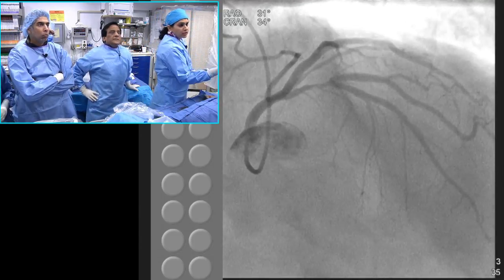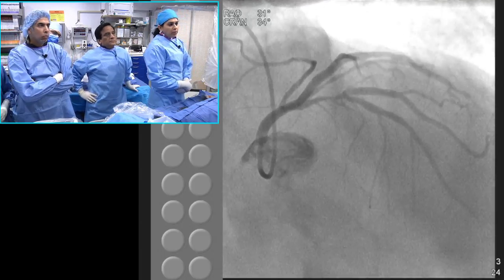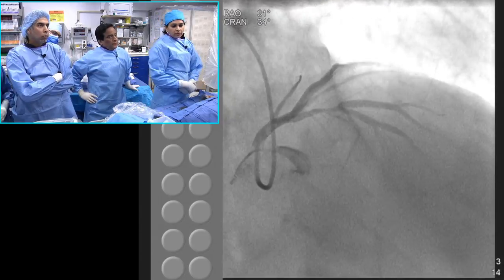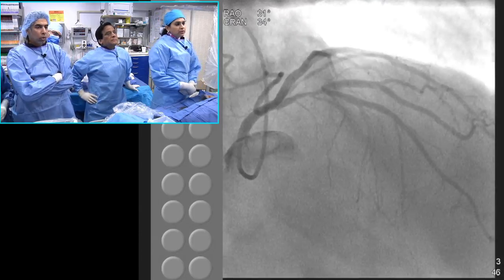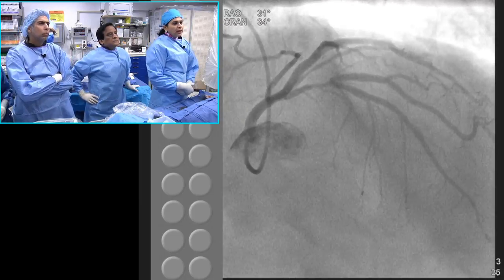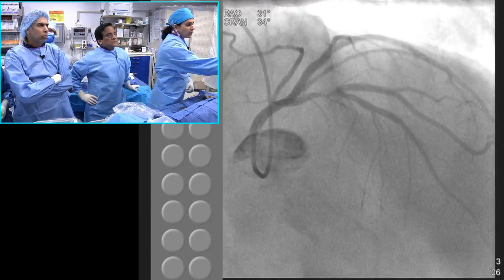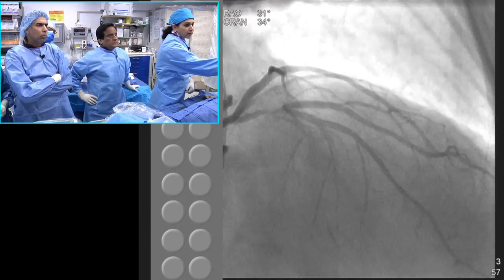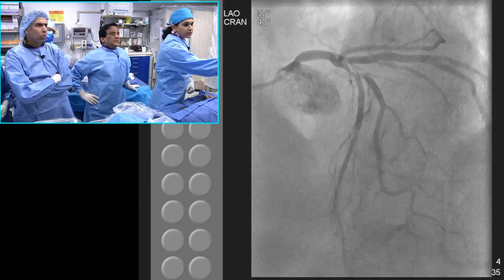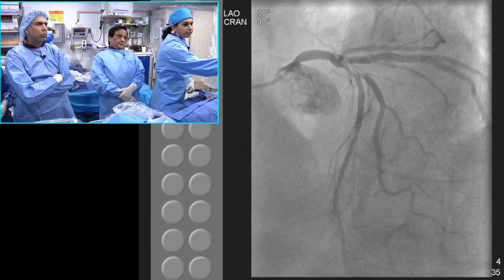And this is the LAD. I think we called it a prox, the same bifurcating disease. What did you call? 101. So the disease starts proximal to the bifurcation, distally maybe less than 30%, but definitely involves the diag, and important is that the size of the diag is as large as the LAD. So it's a very important vessel. Yeah, this is a good view which will show that the ostium of the diag is involved.